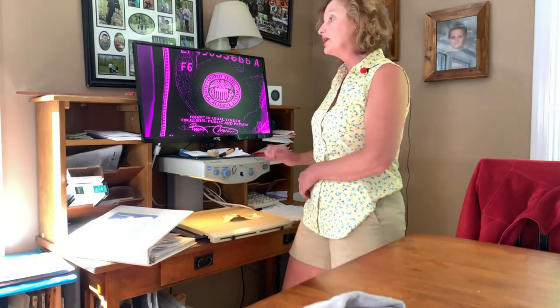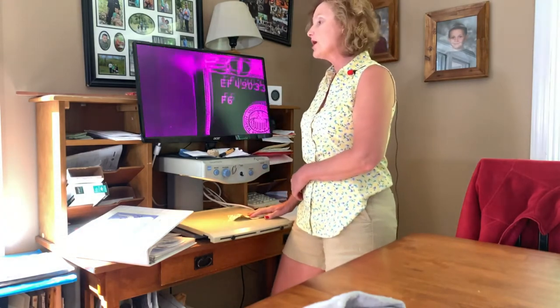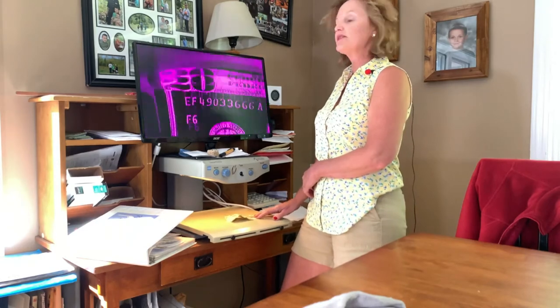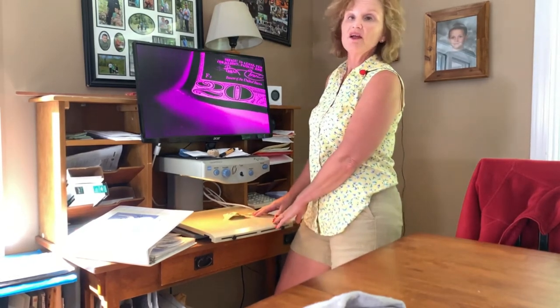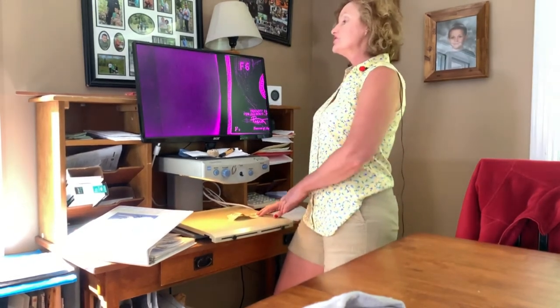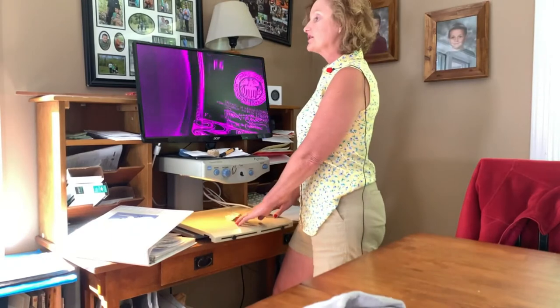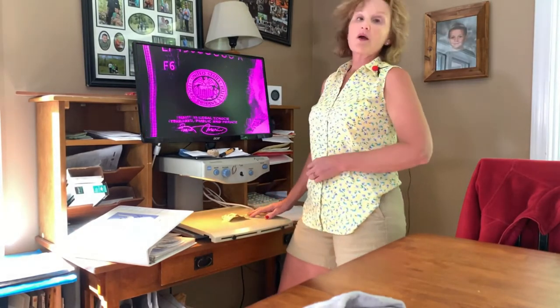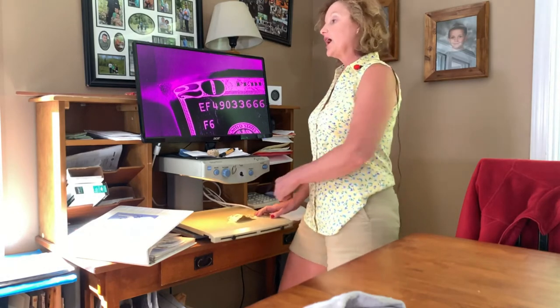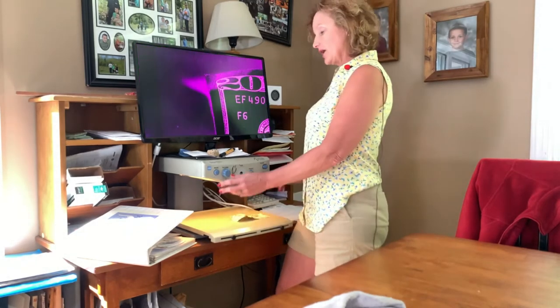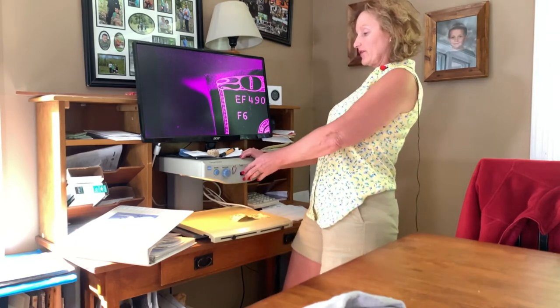This CCTV also has autofocus, meaning when I put the object onto the XY tray, the image will automatically focus in. You can purchase CCTVs that don't have that feature, and they are significantly less expensive.